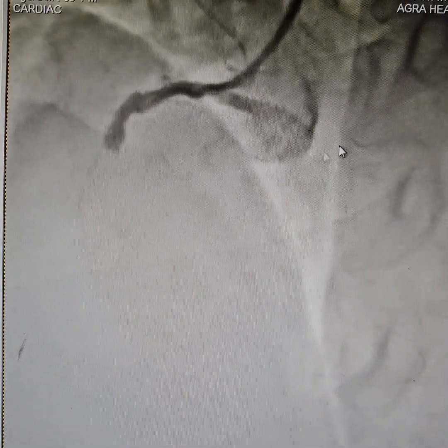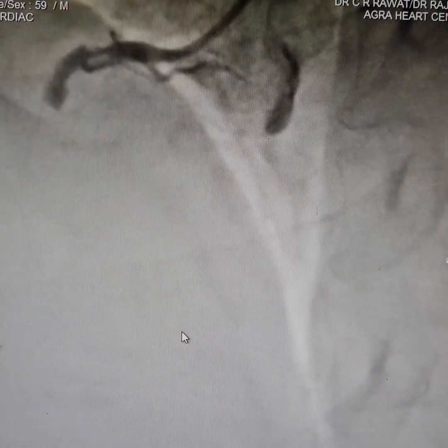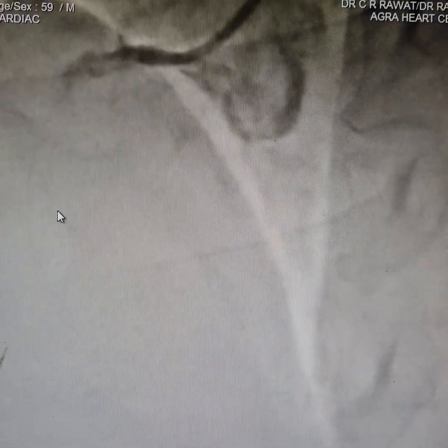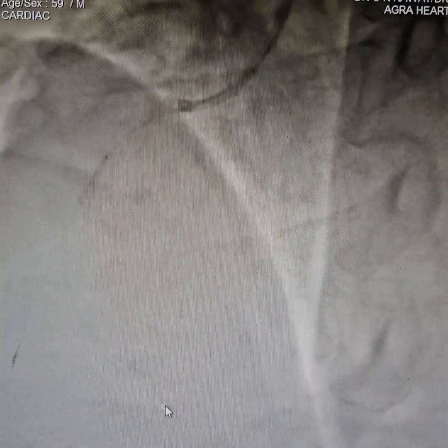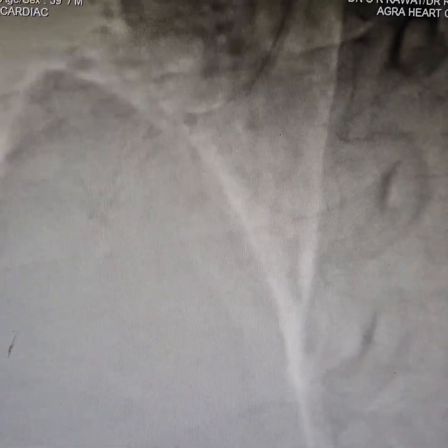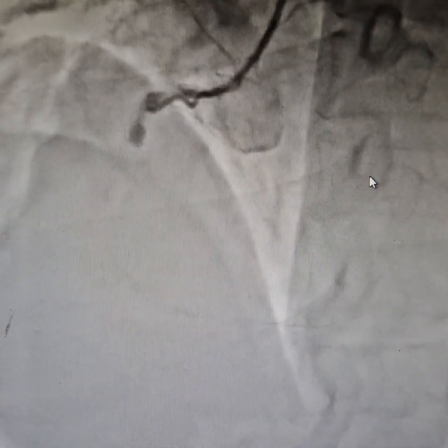We did some thrombus aspiration catheter application. However, as you can see, even after 2 or 3 passes of the thrombus aspiration catheter, flow has not been restored. We did some pre-dilation, but because we could not see the end artery it was quite challenging. Even after aggressive pre-dilation, the flow has not been restored. We are again doing some passes of the thrombus aspiration catheter — still no flow in the mid or distal segment. The 100% cut-off remains.